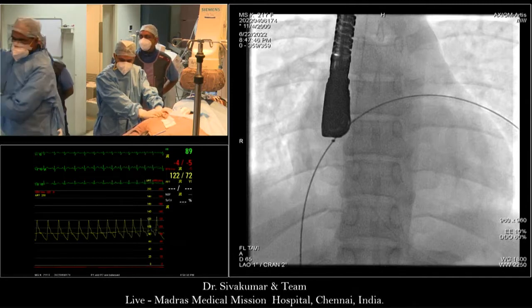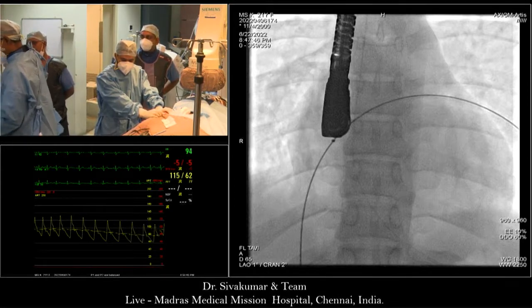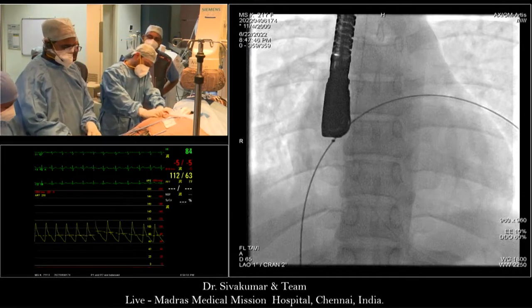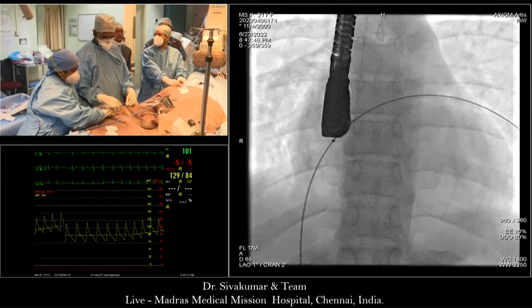Yes, I think we all agree that 40 is oversized. We all agree that 36 is undersized. So a few millimeters less, with 38, it may work. Yeah. Jay Young, any questions from the online?